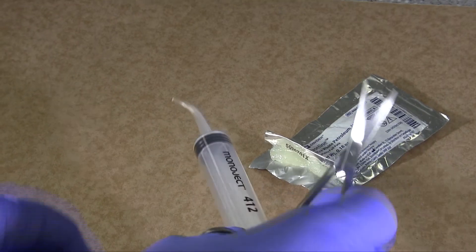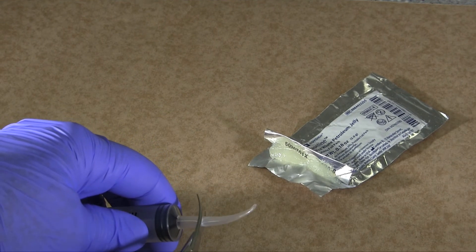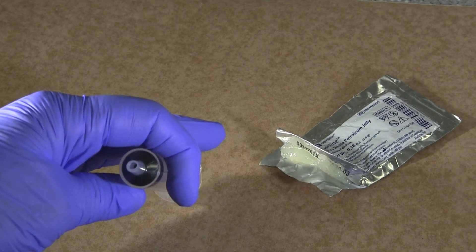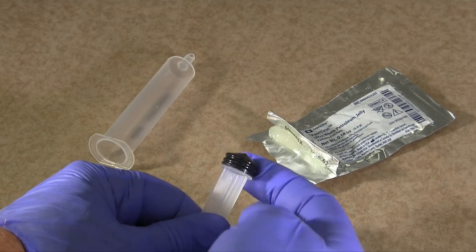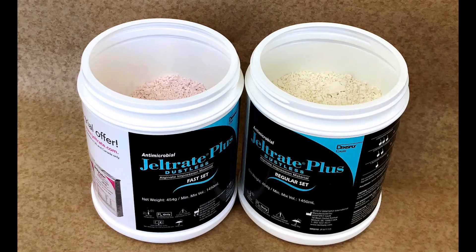Prepare a 12cc disposable plastic syringe by cutting off the tip at a position that will produce a 4-5mm opening. Lubricate the plunger and set aside. Pre-measure material in a non-contaminated area. Do not take containers to your operatory. Irreversible hydrocolloid comes in both fast and regular set. For the technique described here, use regular set.